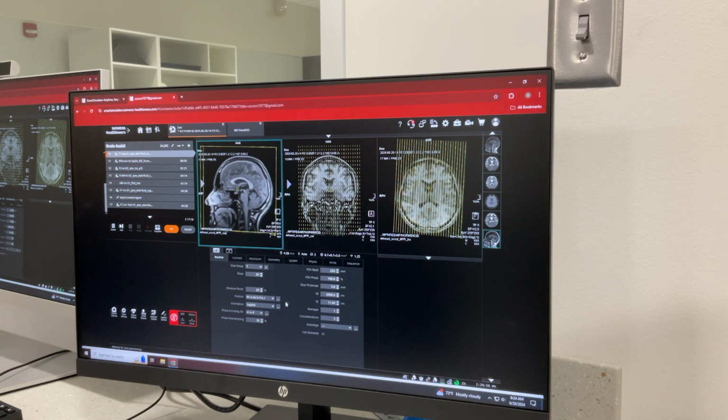Once you do that, what are we angling with? We're setting up the sagittal, so what are we angling with? We want our slices to angle with what?